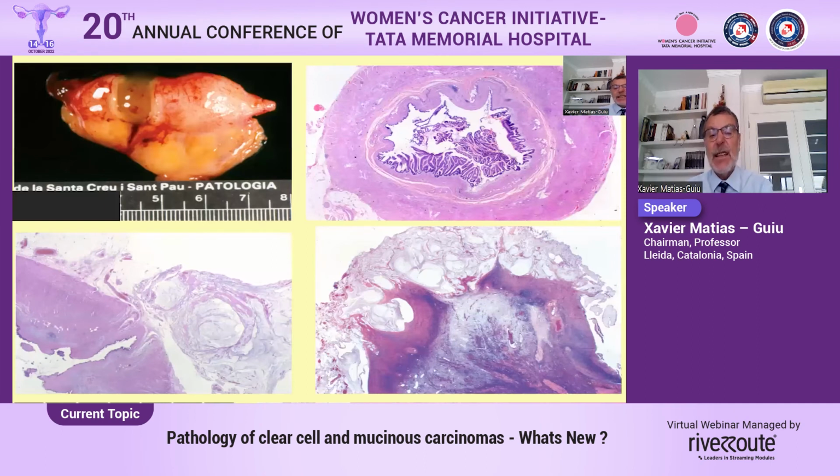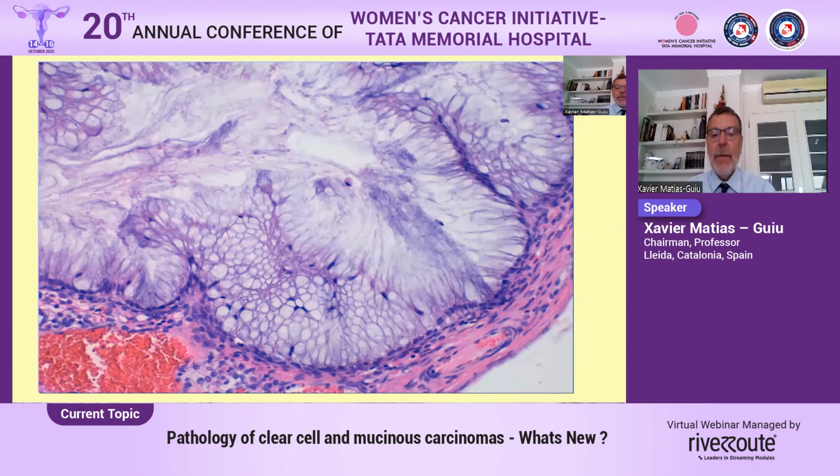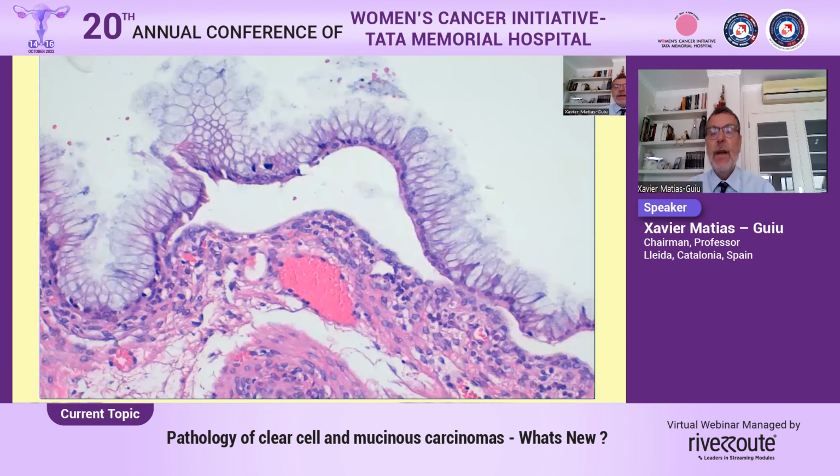So this is just an example of this, an appendiceal primary tumor, and how the metastasis was composed of cells that looked benign or borderline. The hypersecretory appearance, lifting of the epithelium in comparison with the stroma. These are helpful features in differential diagnosis.